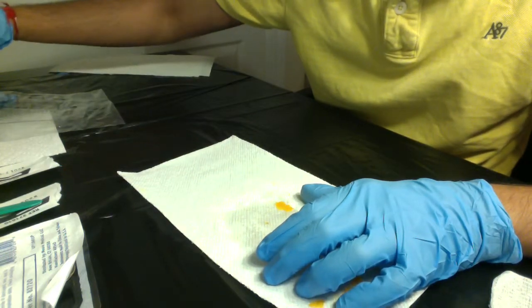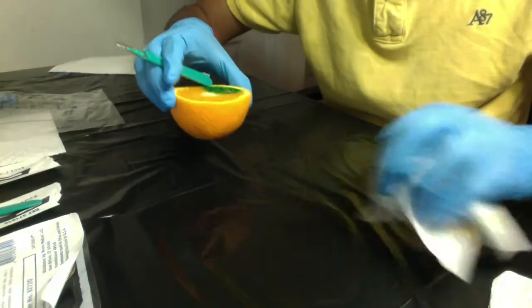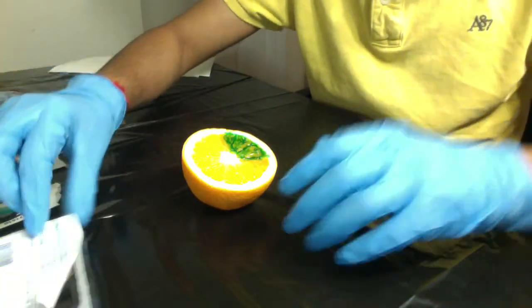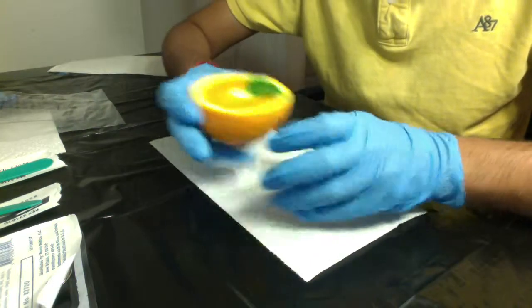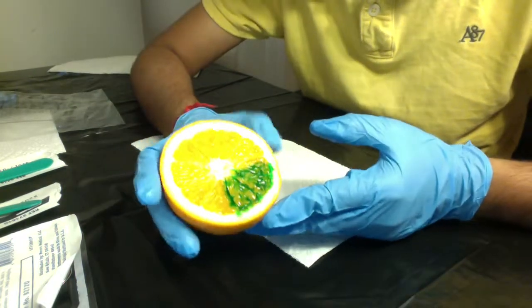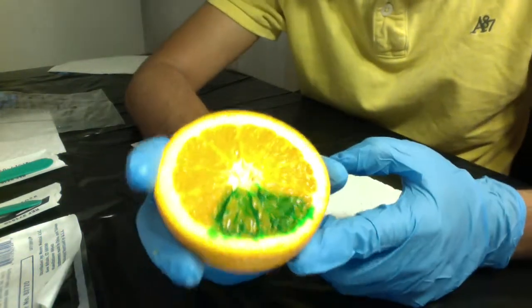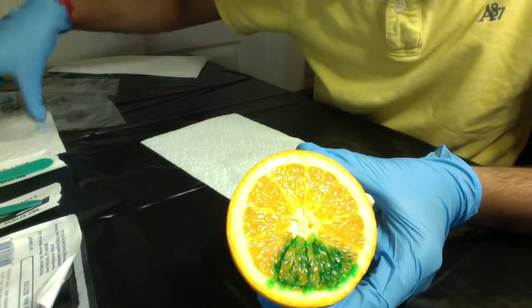Now, for the purpose of debridement, sharp debridement, using the scissors and the forceps, I'll be again using the orange. I've dyed it using a green dye, which closely resembles my wound tracing here.